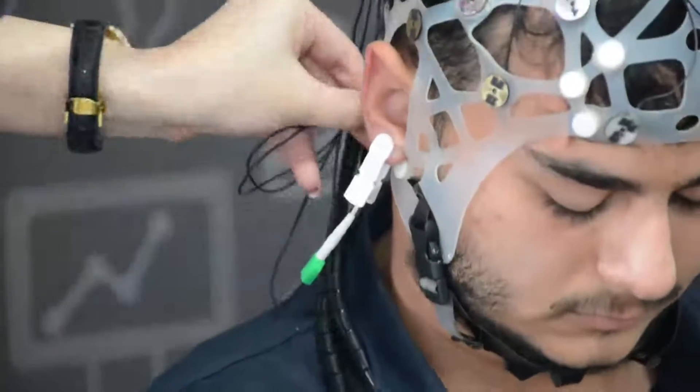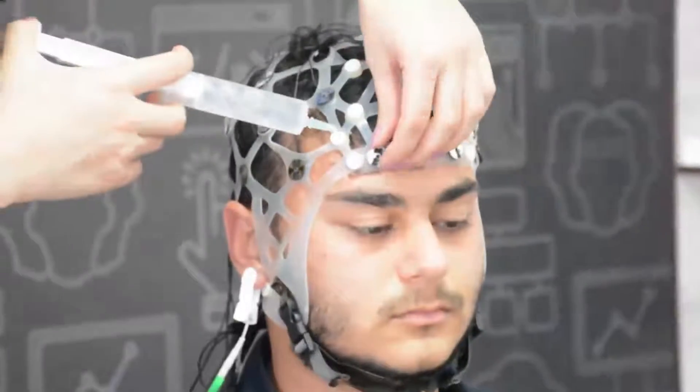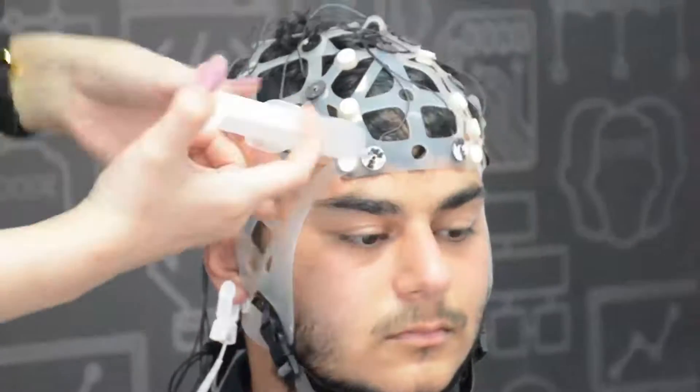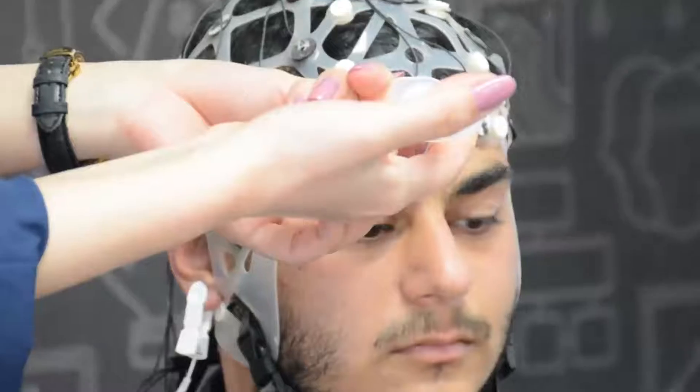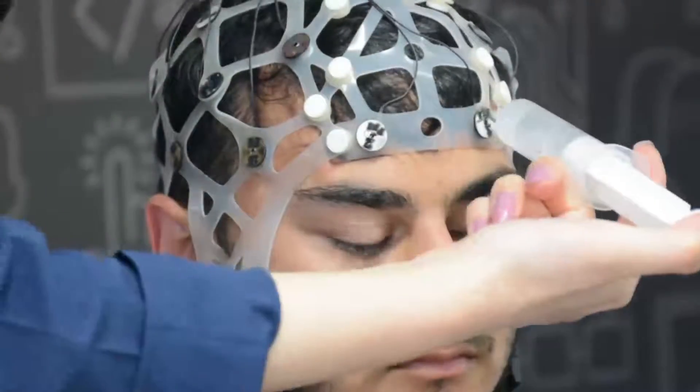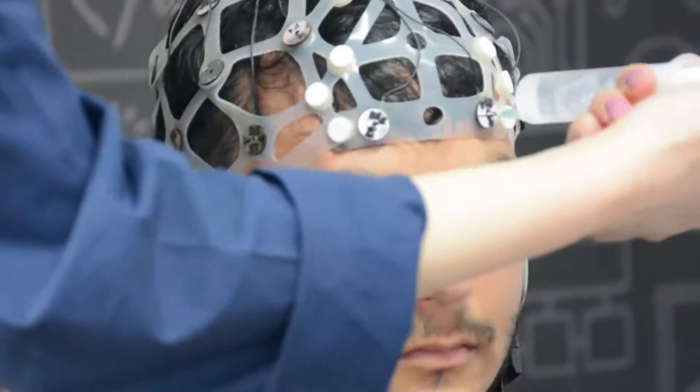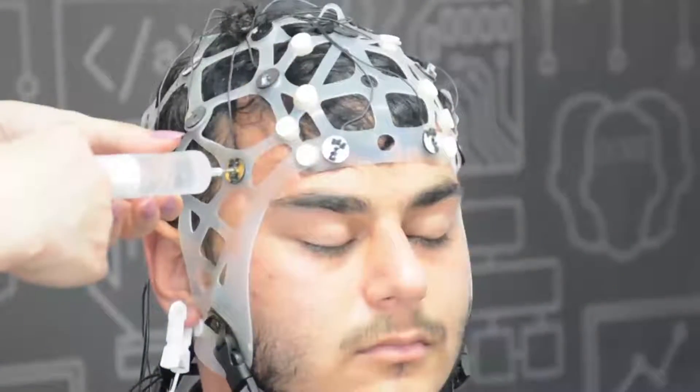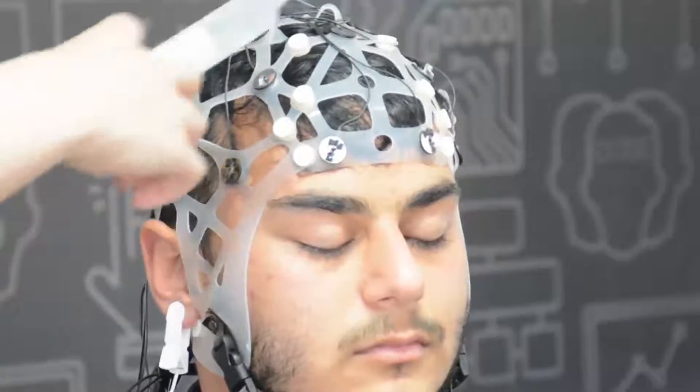After that, start injecting gel into the channels. One of the particular advantages of the EEG eWave device is that there is no need to use special EEG gels or paste, just ultrasonic gel, which is much more cost-effective and reduces the cost of treatment.